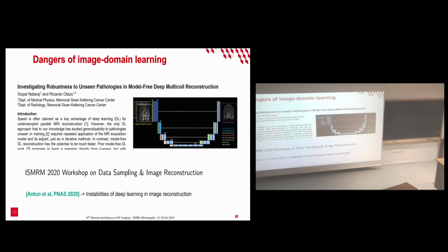And of course, people have started to use that, in particular the UNET, because it was originally introduced in 2015 for image segmentation and so on. But for image reconstruction, people realized almost in 2020 that it's not the right approach, because you can produce some hallucination effects. Once you have removed the aliasing effect using the encoder and decoder decomposition, you can end up with some spots, for instance, or you can either miss some features or add synthetic, or I would say unrealistic, features in the image that were not present initially.